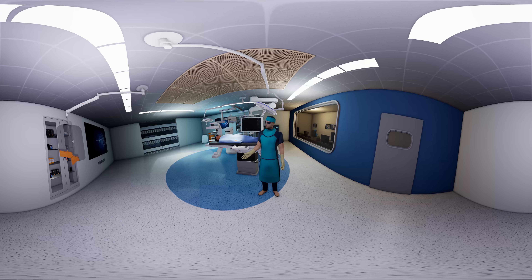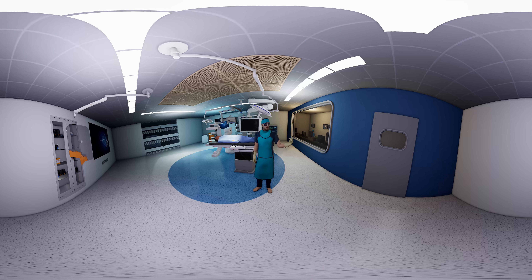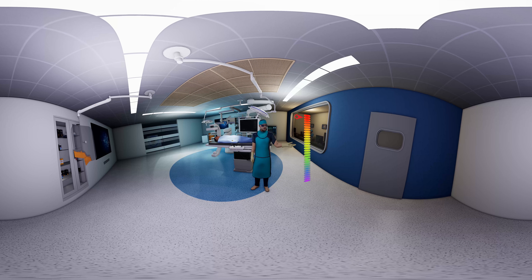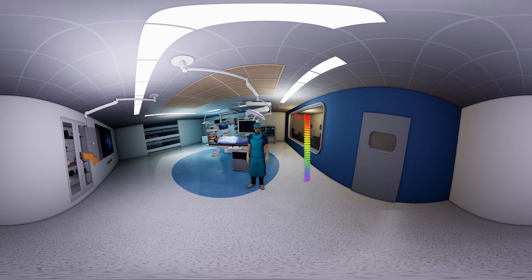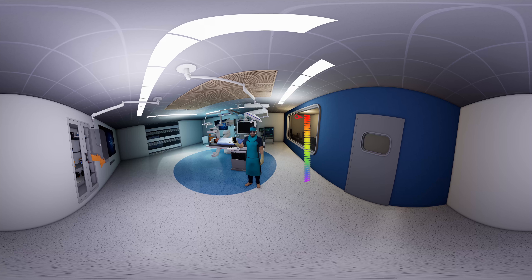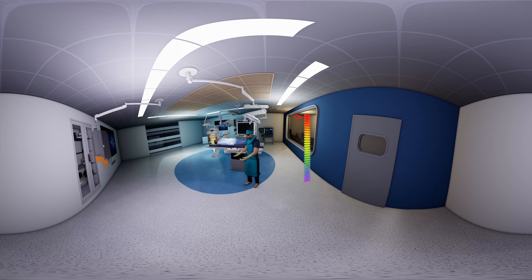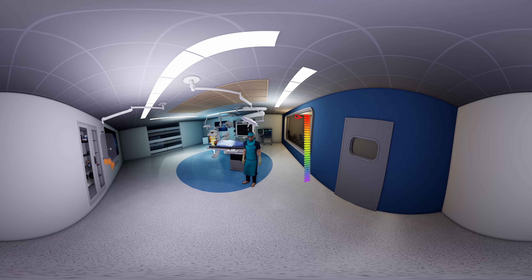Let us start by activating the x-ray machine. X-ray on. On your right there is a virtual dosimeter that measures your x-ray dose exposure level — as you see, it's high right now. X-ray is produced from the tube directed to the detector. This radiation is the primary beam.